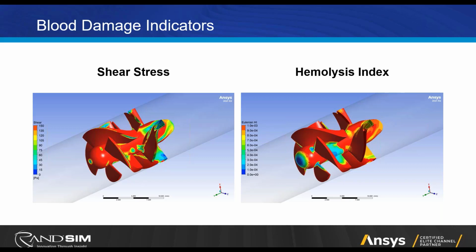And you can see, obviously, red is high, so a very large amount of the turbo surfaces are in excess of our 150 threshold, which is normal. You expect that to happen. We try to minimize it, and we try to reduce the amount of recirculation and stagnation that occurs. And you can see the blue area is in the trailing edge and the tail of the diffuser there on the right side of that image. So those are areas that are potentially where thrombosis could occur because we are shearing the blood quite a bit.